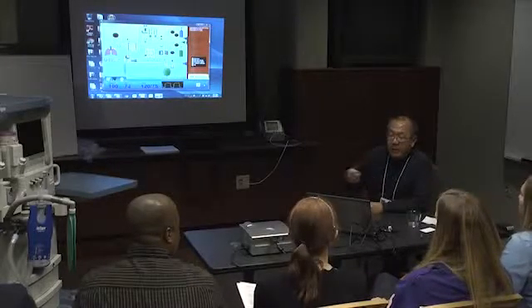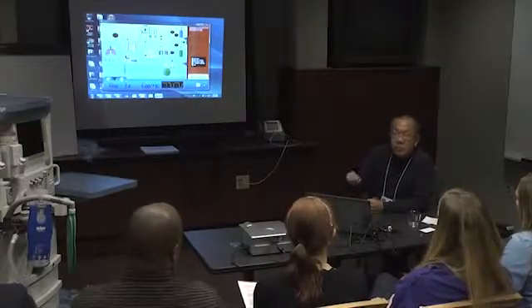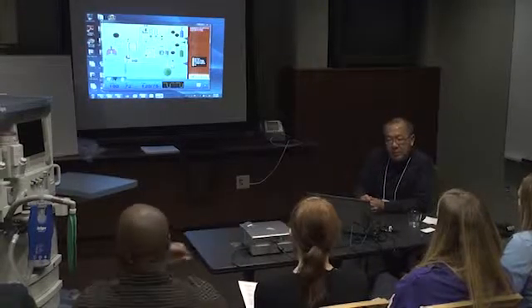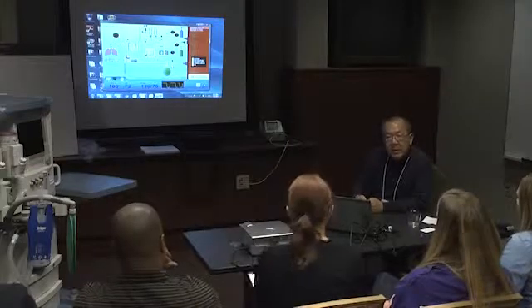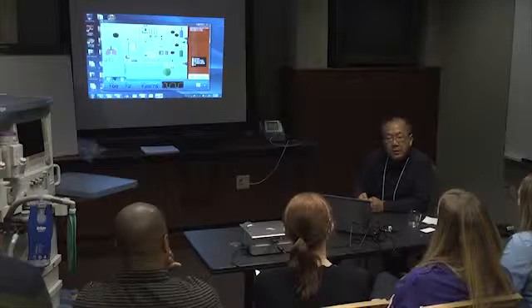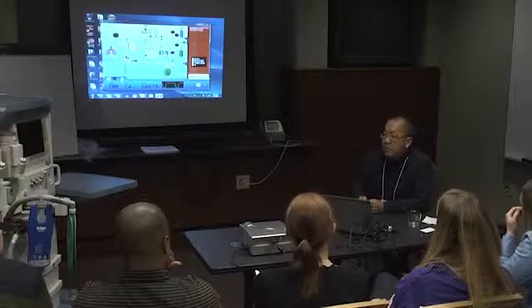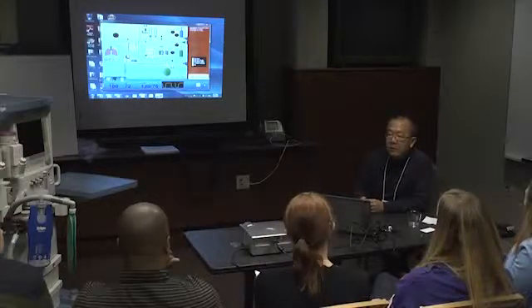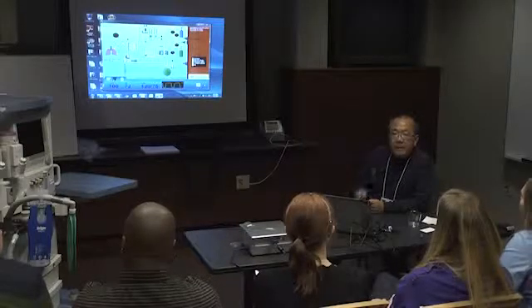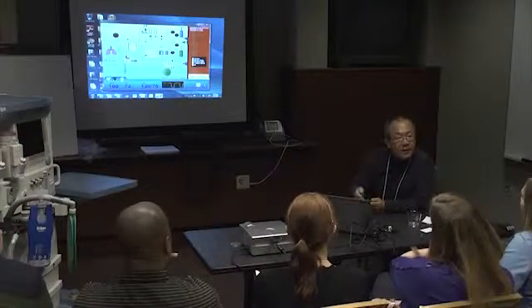Did I tell you about that case in New Haven, Connecticut already? No? Okay, so this is real. I talked already about the case in Texas. This also happened more recently in New Haven, Connecticut. And the sad part was it took 2 deaths for the failure to be detected. The first case was a conscious sedation case. No anesthesia machine was involved. The first victim was an older lady, conscious sedation with nasal cannula, and she desaturated because she was getting nitrous, not oxygen.